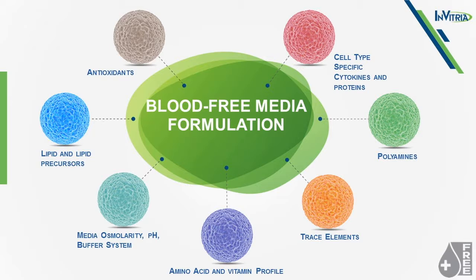So although there are some clear advantages to going completely serum-free over, say, reduced serum cell culture, there are some obvious hurdles as well. Primarily, serum-free media formulation is somewhat complex, and the time investment is much more demanding to develop a totally chemically defined serum-free media formulation than it is to simply reduce the serum in your cell culture. So there are a lot of other considerations that you have to look at.